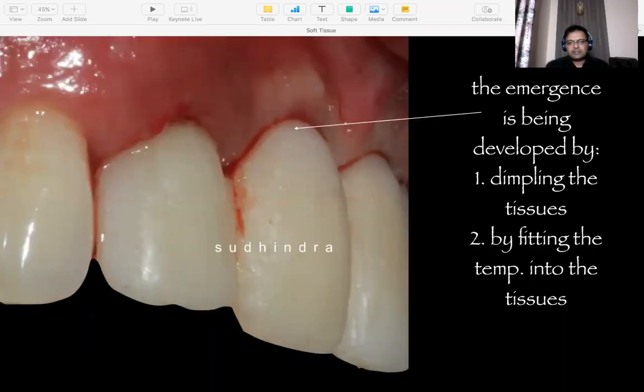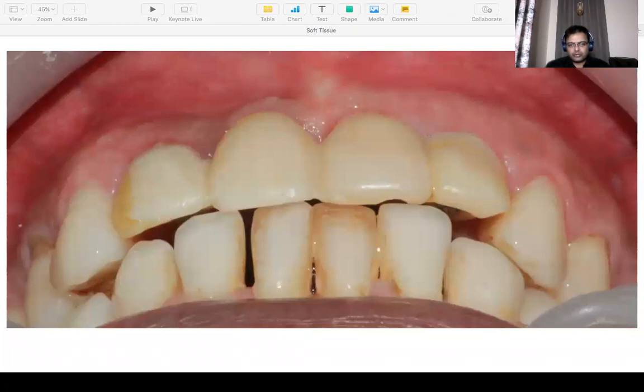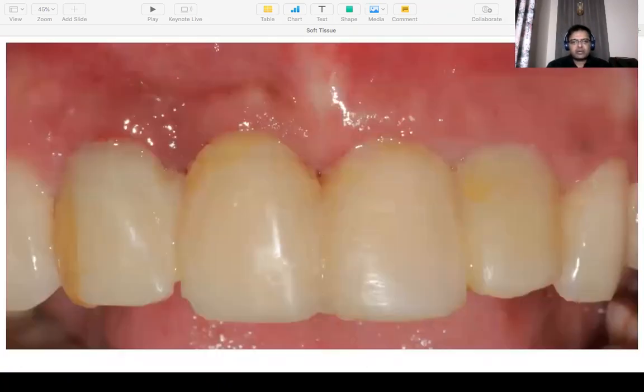Okay, and this dimpling was slowly contoured over a period of time. And that's what you see. Three months down the line, the patient had this temporary. It was kept on modifying every second week. We used to modify, add or remove as per the contour requirement. And this is how it looked on the day we were going to make the final impression.